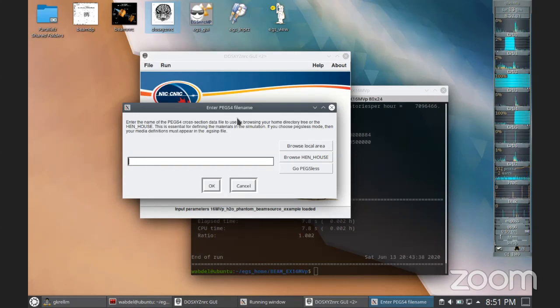There are many people who say, look, when I read from a phasespace file, the application opens the file, reads the particle, and then does the simulation. This time to open and read from the file, especially if you have a magnetic disk, could be comparable to the time required to model a history through a linear accelerator. But if you have a solid state SSD disk, then reading from that file is probably going to be very fast.